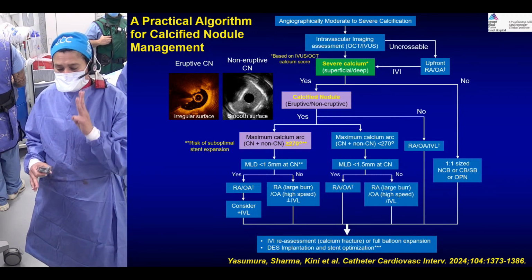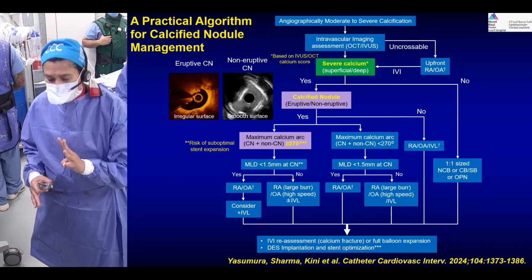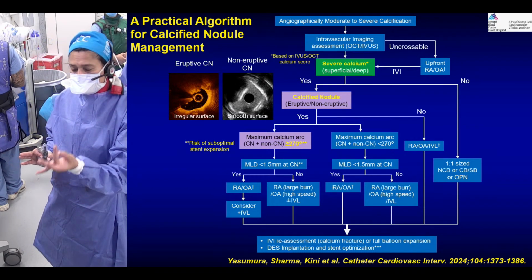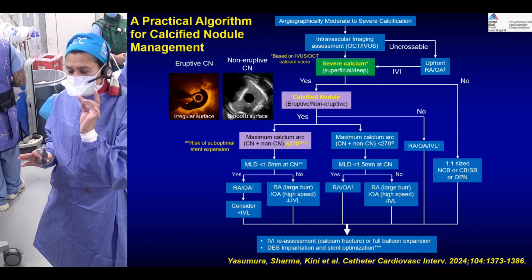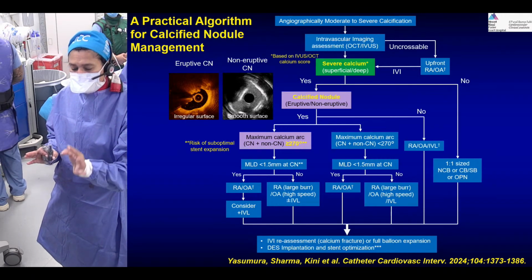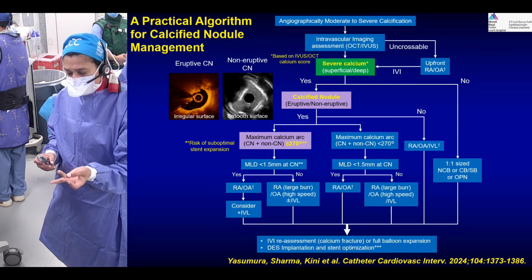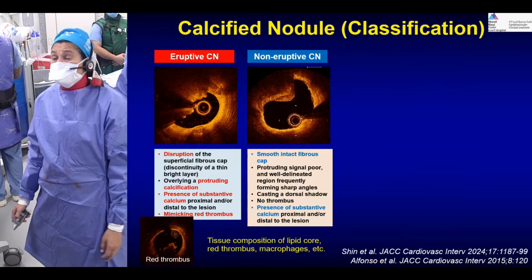Like I said, most of the time you probably need 3 imaging runs: pre, plus or minus after you've done an atherectomy to decide if you need an adjunct device, and at the end after the stent, plus or minus one in between. We did 4 total here.